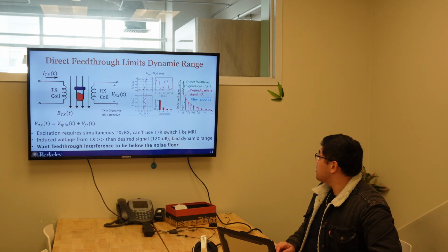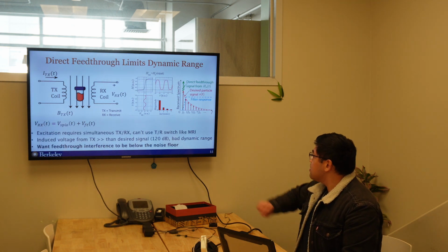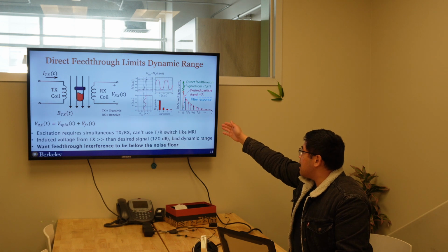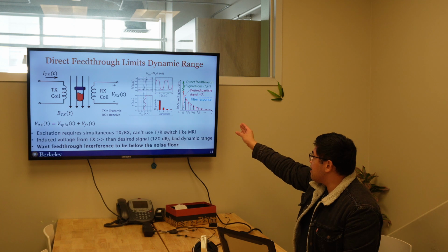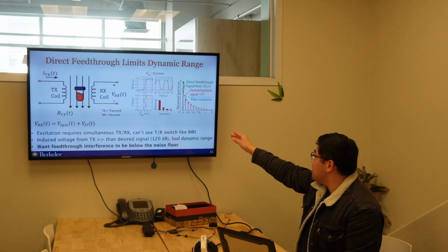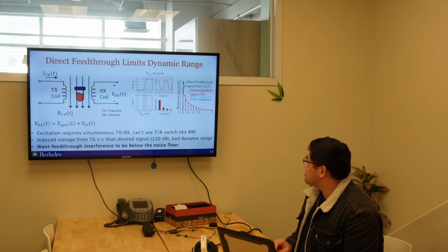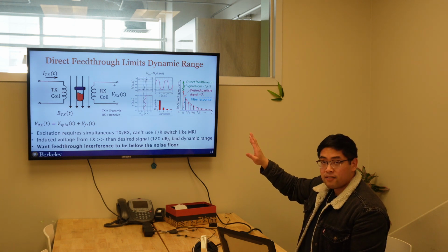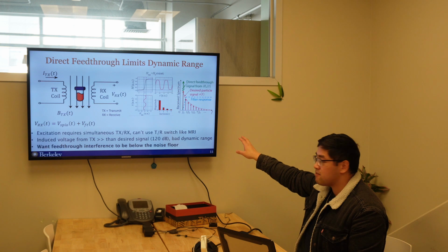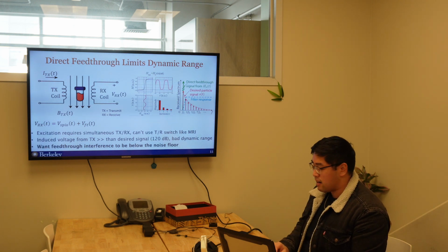And then if you plot the Fourier response of our particle signals, you'll see that at the fundamental, we have a huge energy content due to that feed-through. But it also contains our desired particle signal. So what we do to address this is that we use a very high-order, high-pass filter to filter out that first harmonic. And we reconstruct our particle signal, our image, using the rest of the harmonics.